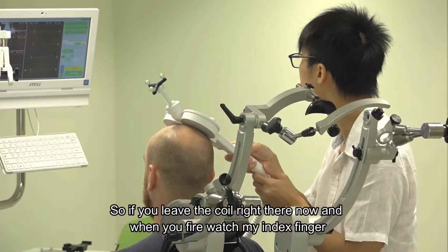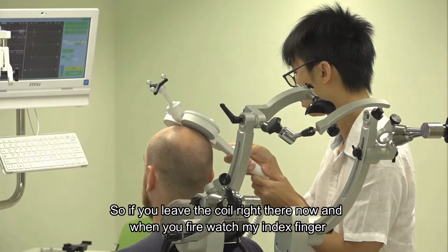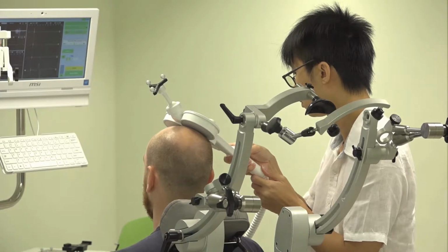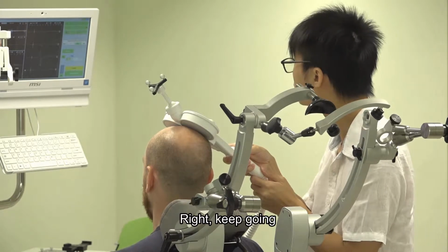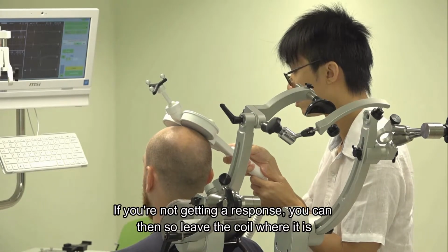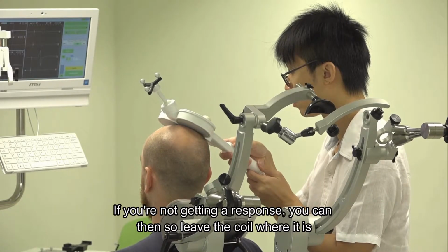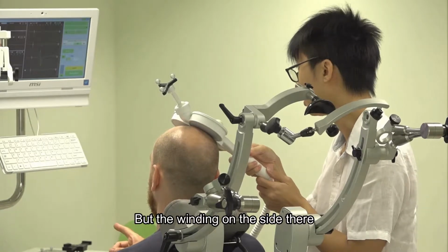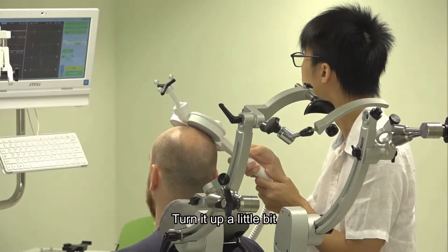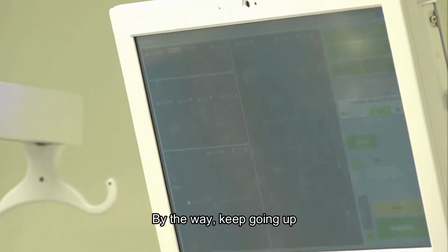So if you leave the coil right there. Yeah. Now, when you fire, watch my index finger when you fire. Oh, we missed it there, unfortunately. Right. Keep going. Turn the stimulator up a little bit. If you're not getting a response, you can leave the coil where it is, but the winding on the side there. Yeah. Turn it up a little bit. Other way. Turning up. Keep going up.